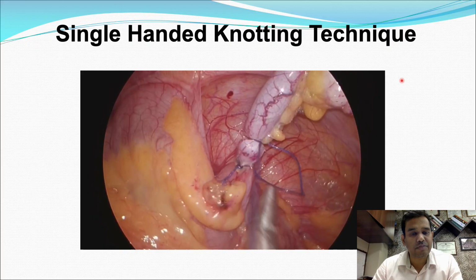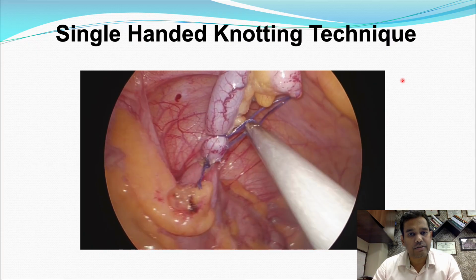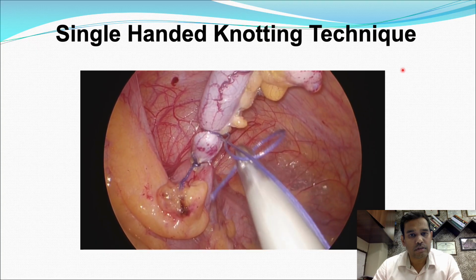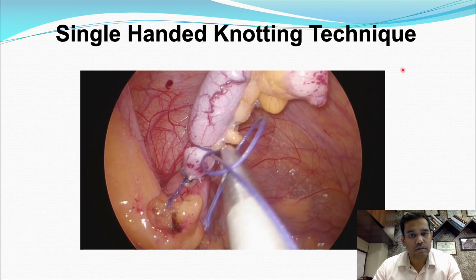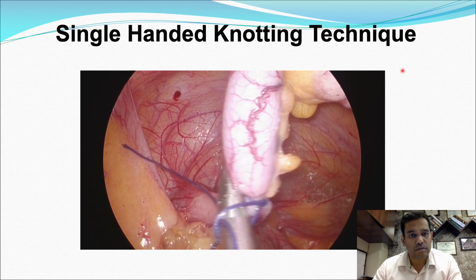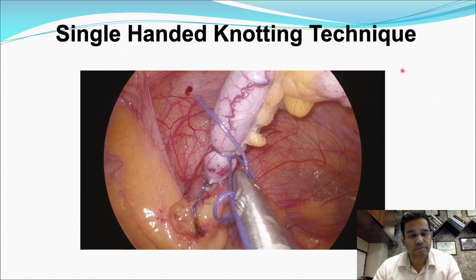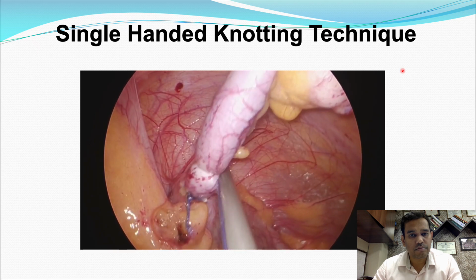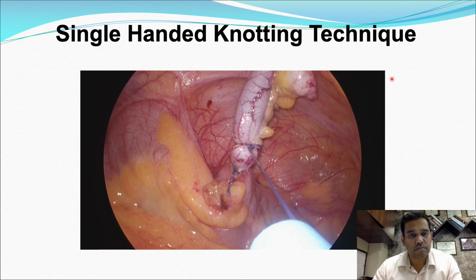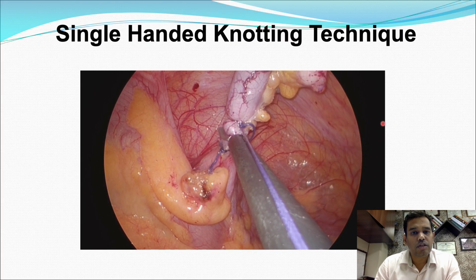I'm giving a counter traction with my left hand, which is holding the long end of the suture outside, so that the knot becomes tight. Now I'm cutting in between the two sutures.